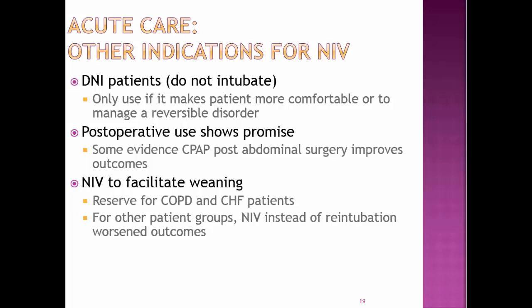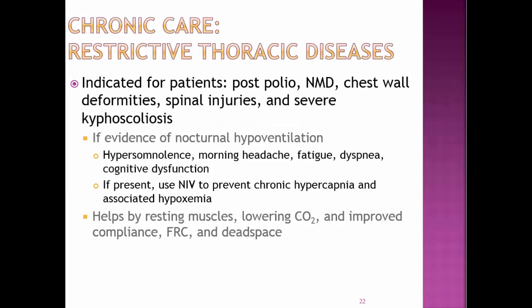Postoperative use shows promise. Some evidence shows CPAP post-abdominal surgery improves outcomes. To facilitate weaning in the COPD or CHF patients. For other patients, NIV instead of reintubation worsens outcomes. This may also be helpful in restrictive thoracic diseases.